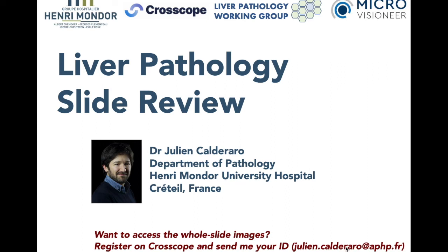So welcome to this new case of the liver pathology slide review. It's a classical, straightforward case, but it's a classical trap that you will have to remember. So here below is the information if you want to access the whole slide on Crosscope.